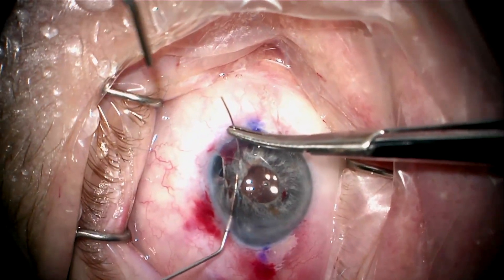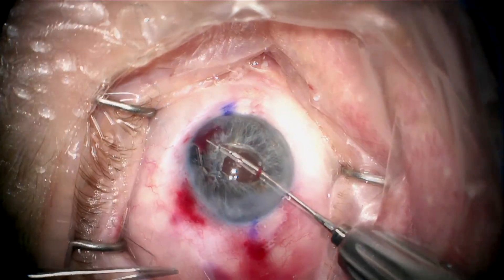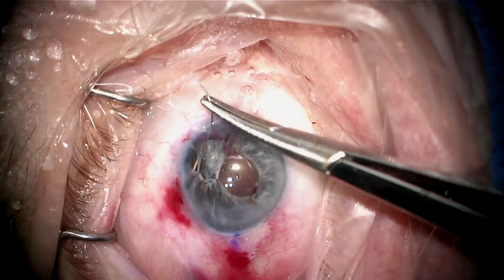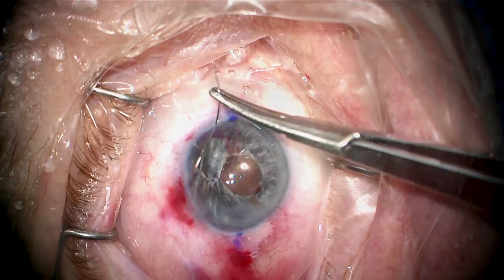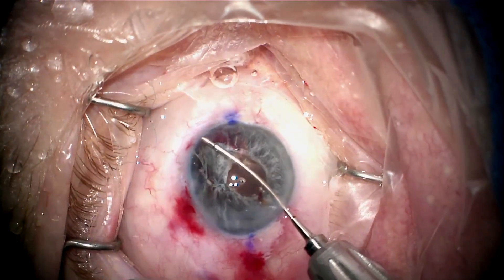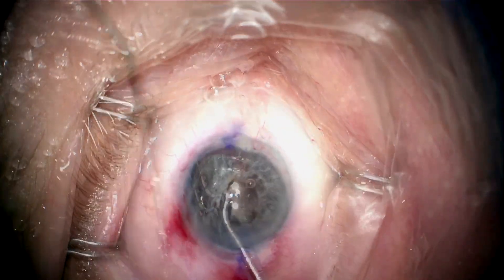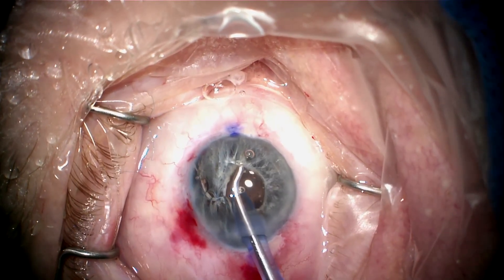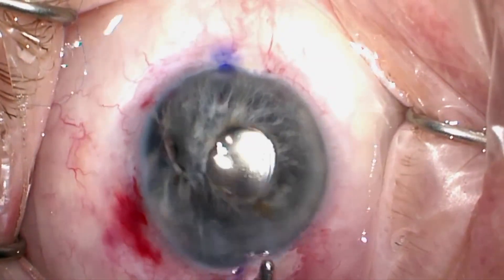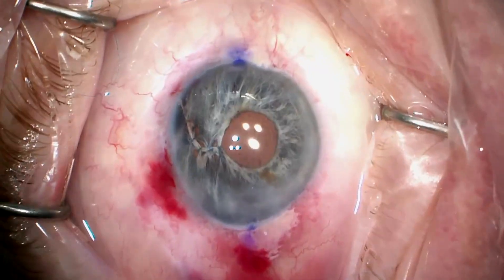That's because it's under a lot of tension as I try to bring this together. I keep adding sutures to close, reinforce, and bring this together. I'm happy with the pupil shape and position. The dilator fibers on the right side of the surgical field are working and intact — not on the left side — so when this pupil comes down, it's actually going to be perfectly centered. I removed the viscoelastic and the case is completed. I think this patient is going to be very happy. Thank you very much for your attention.